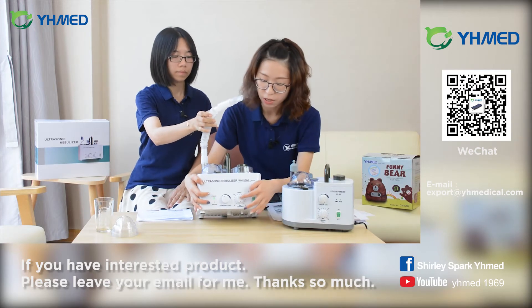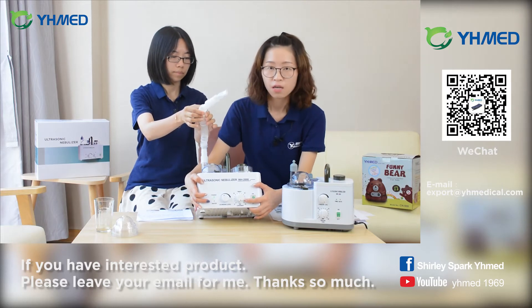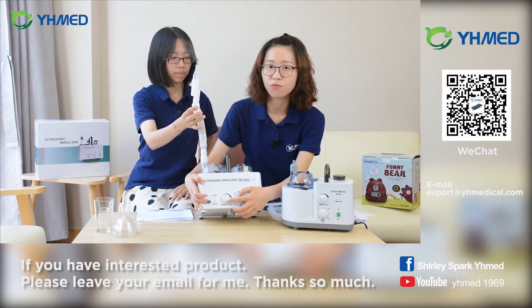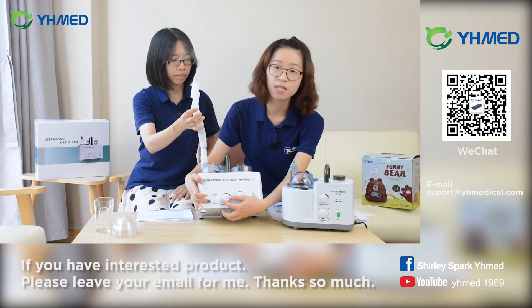Now I will introduce two functions for you. This is the timer knob — you can adjust it to the required time. And this is the flow volume knob, which can also be adjusted by turning this knob.